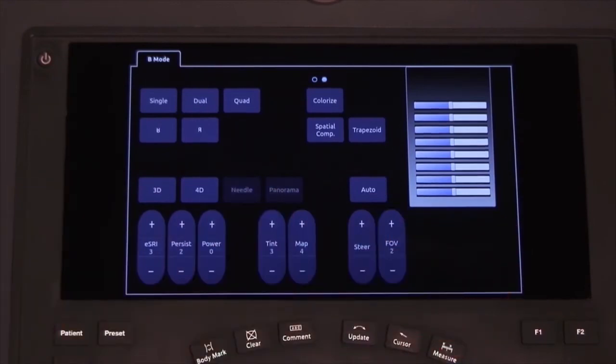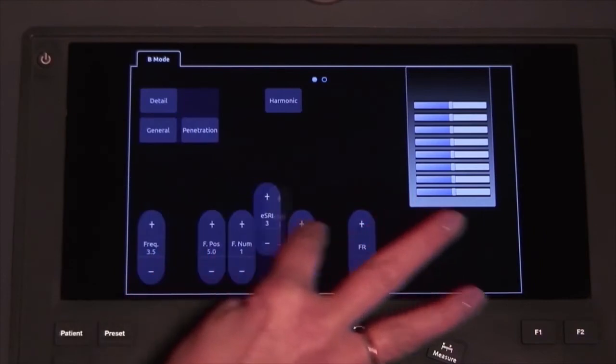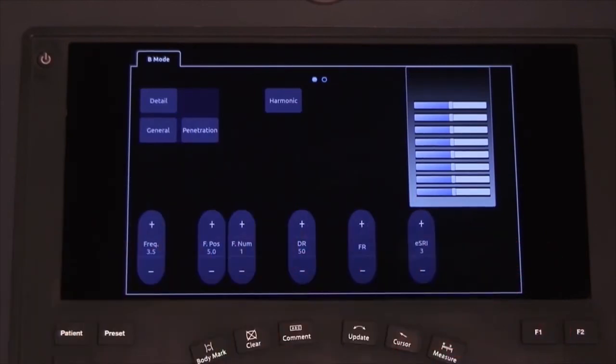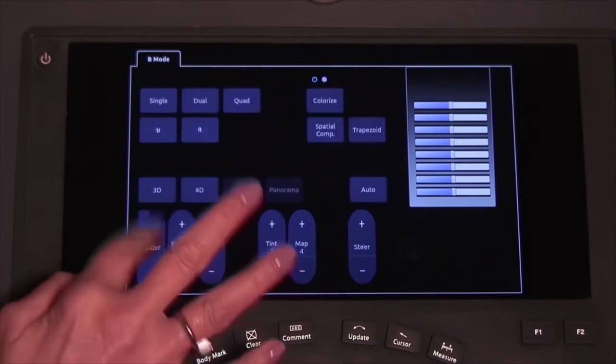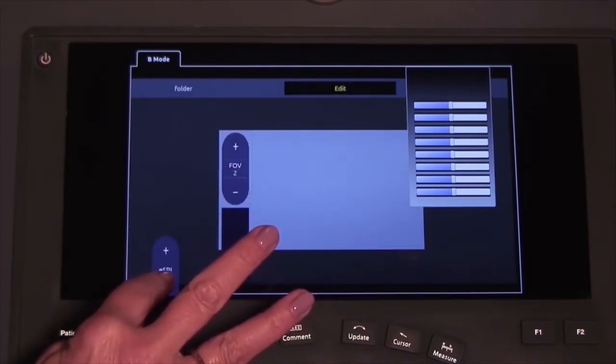Incorporated into the design of the 10-inch touchscreen is functionality that you are familiar with from your smartphone. You can completely customize the user interface to meet your workflow preference and maximize efficiency. Functions that are less important to you can be moved to a second-tier location, making your personal go-to controls all the more accessible.